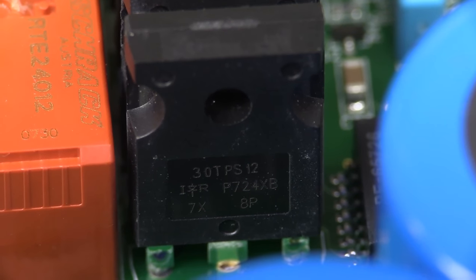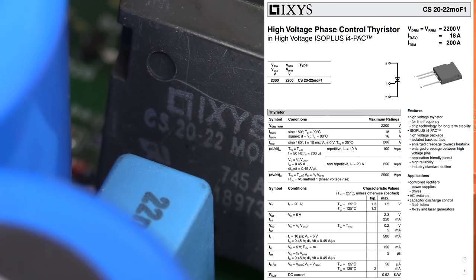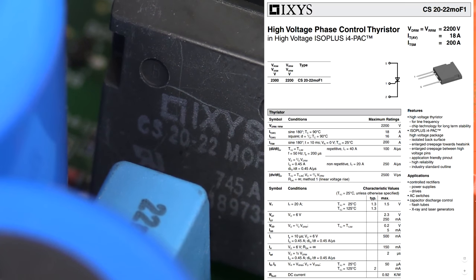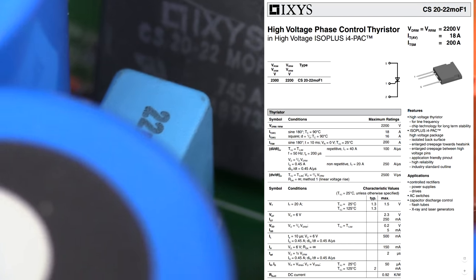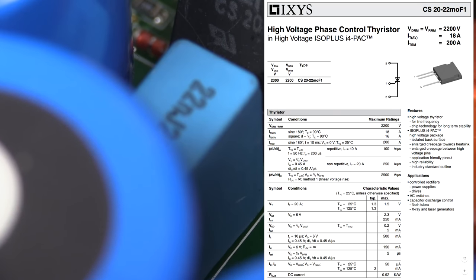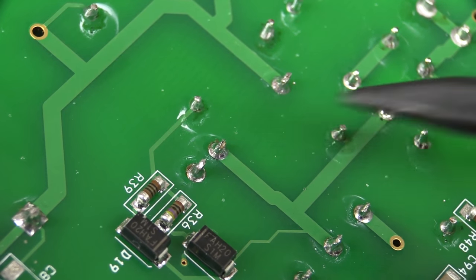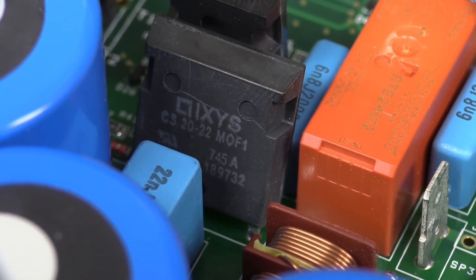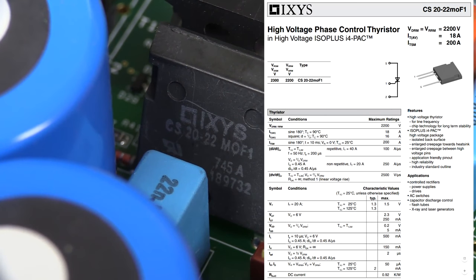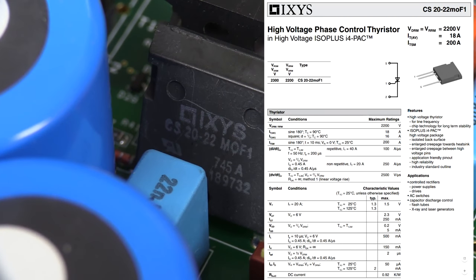Those SCRs are 1200 volt packages, but they're small fry compared to the big daddy over here — an Ixys CS2022 in this fantastic ISO Plus package. The reason it's called ISO Plus is the hugely wide pin spacing — two pins close together on one side and then massive pin spacing on the other. That's how they get the 2200 volt isolation on this baby. This is a serious bit of kit — it's a phase control thyristor, otherwise known as an SCR. Once you latch those on, they stay on until the voltage drops to bugger all.